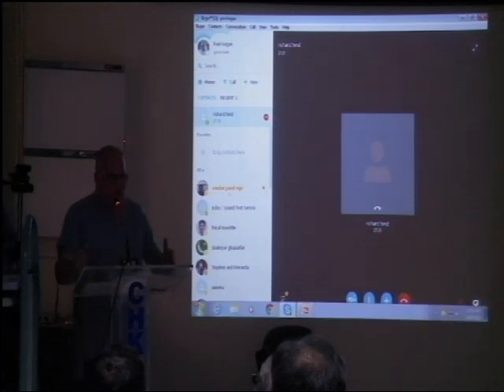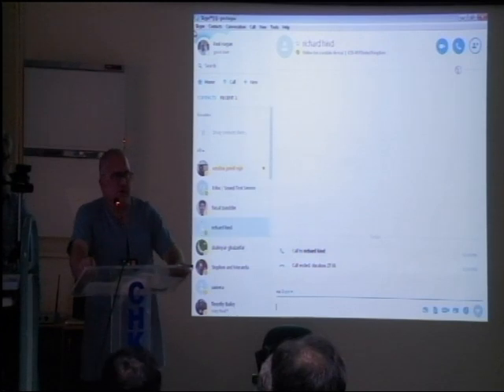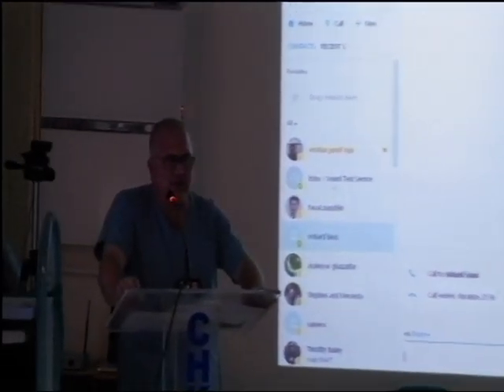So the message from there, really, I know that a few of you were asking certain questions about tumour markers and CT scans, etc. But the main take-home message is, when you see a polyp, don't just jump blindly into assessing it, into wanting to take it off. You have to take time, you have to look at it, you have to make the correct call. The correct call isn't to go, oh, it didn't lift there, I'll just lift the edges and then hopefully I'll be able to take off the centre.